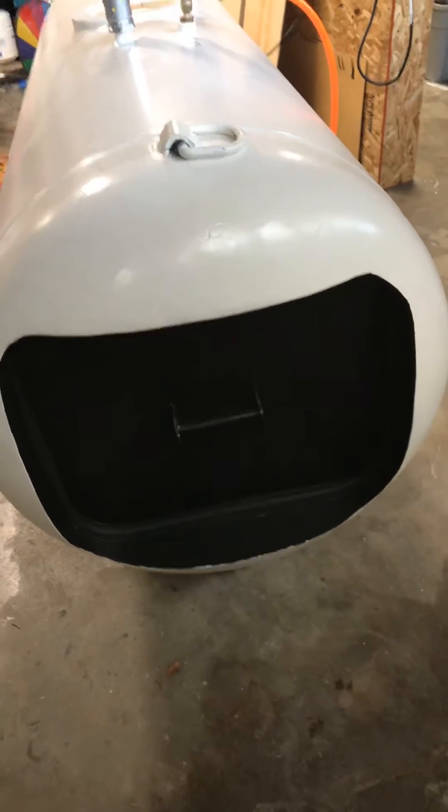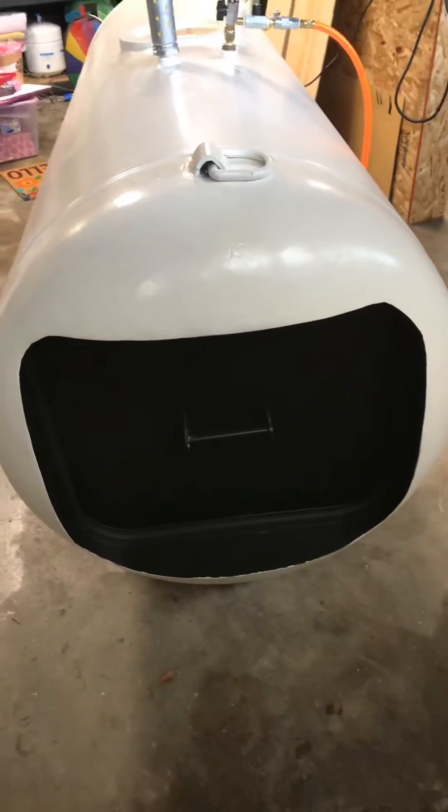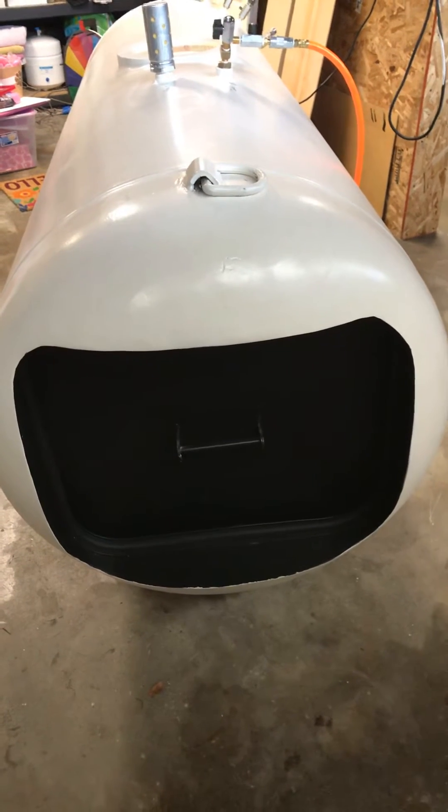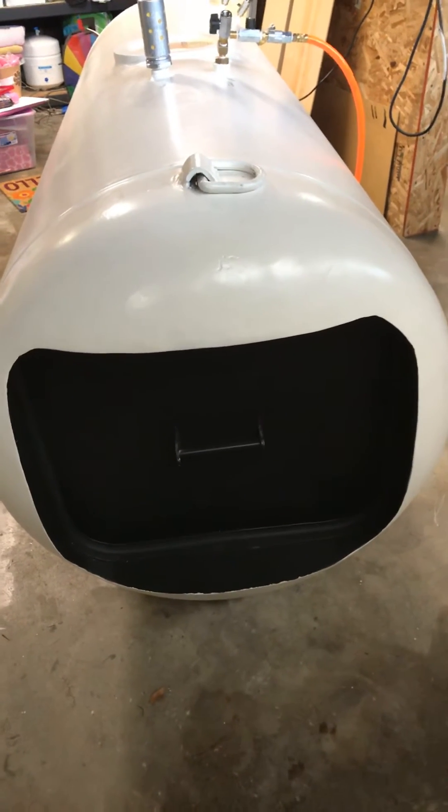Here's the front door. I made it square. The last one I made was round for a bigger tank, but because this one's only 30 inches I wanted to make it large enough for someone to get in. That's a door on a double swivel pin which closes pretty good.